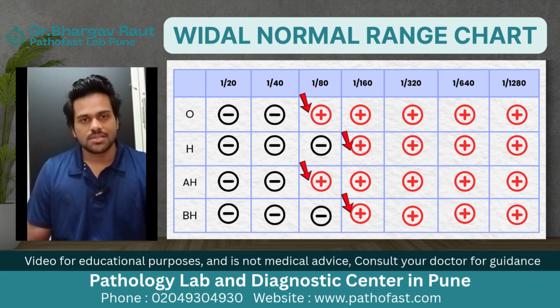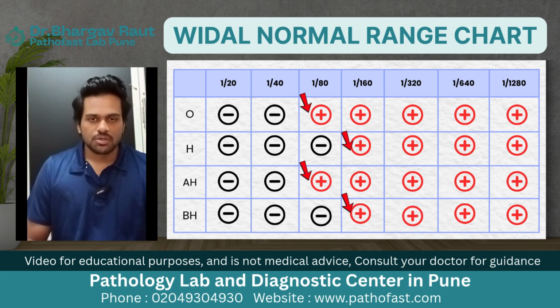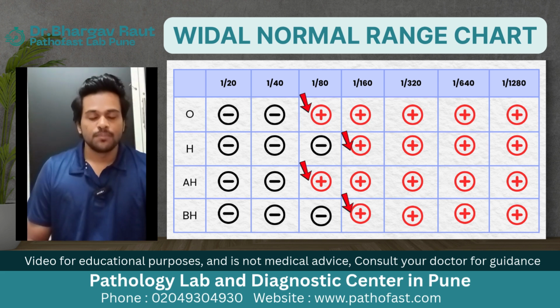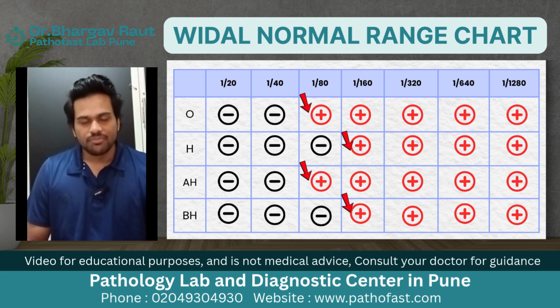The first thing you need to understand is that when we do a Widal test, we progressively dilute your sample. So you can imagine this. Imagine that you have 1 tablespoon of sugar and we go on adding water to it. When I add the first glass of water, I'm going to be able to taste the sugar in the water. But as I add more and more water to that sugar, my ability to sense and taste that sugar will go on dropping. And maybe by the 5th or 6th glass of water, I may not even be able to taste the sugar anymore. So the same thing is done when we do a Widal test.